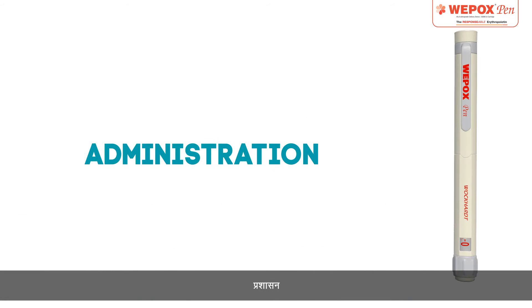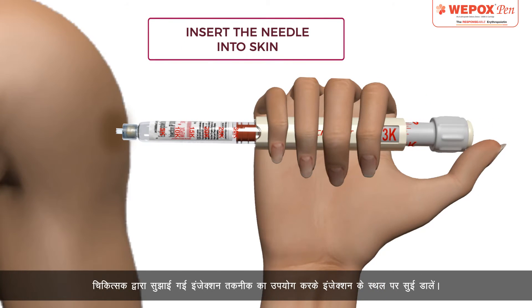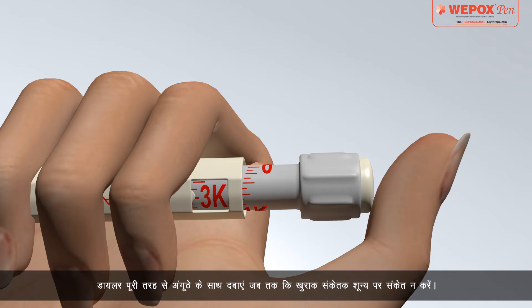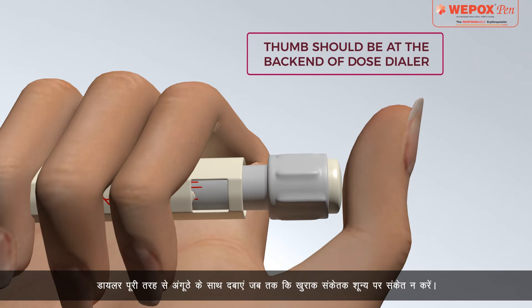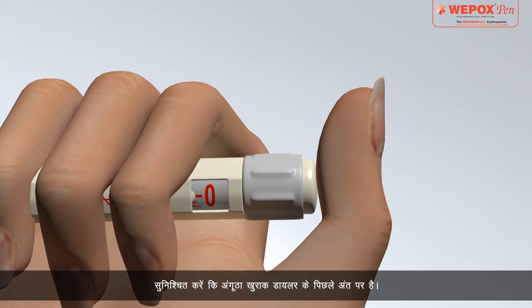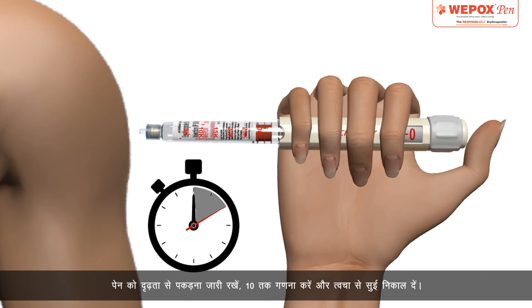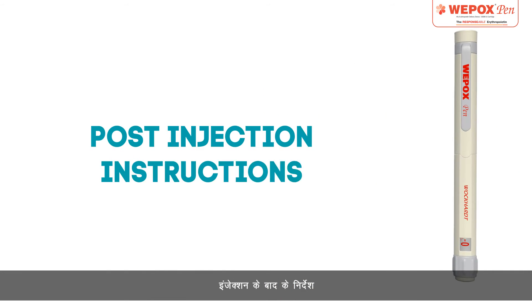Administration: Insert the needle at the site of injection using the injection technique recommended by your doctor. Press the dialer completely with the thumb until the dose indicator points to 0. Make sure that the thumb is at the back end of the dose dialer. Continue to hold the pen firmly, count to 10, then remove the needle from the skin.